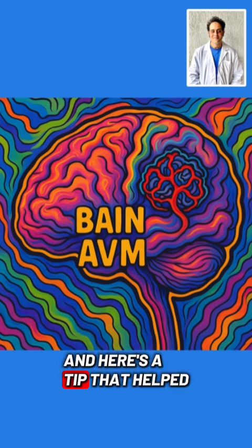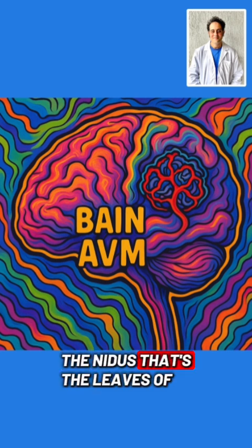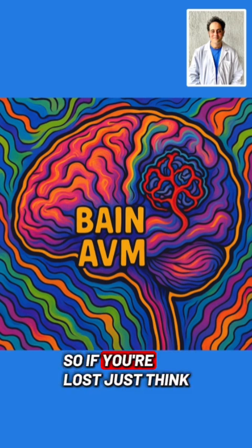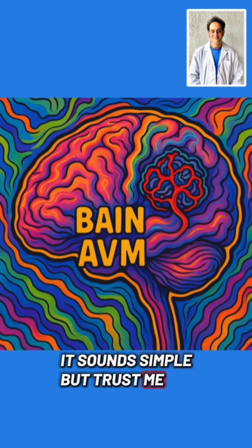And here's a tip that helped me early on. Look at the AVM like it's a tree. The nidus, that's the leaves of the tree. The veins, they're the branches and the trunk. So if you're lost, just think, where's the center of the tree? That's usually where you'll find the draining veins starting to exit. It sounds simple, but trust me, it helps.